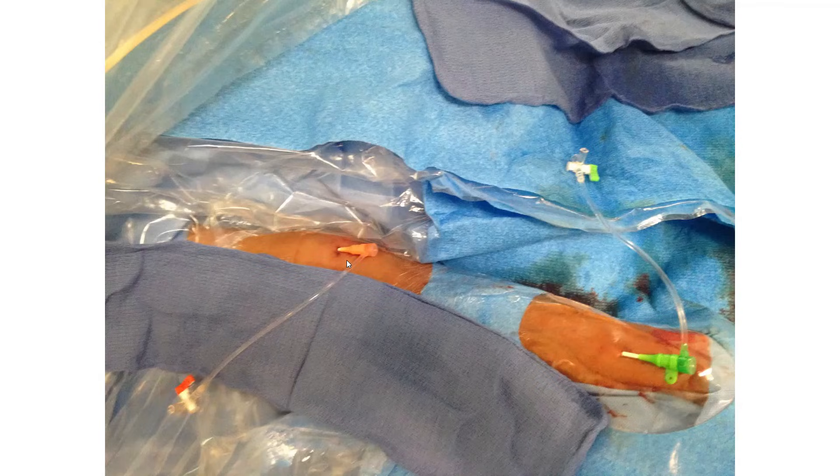Then after the sheath is placed in, then we move the arm into juxtaposed to the body and we place the radial drape with the cut at the elbow level.